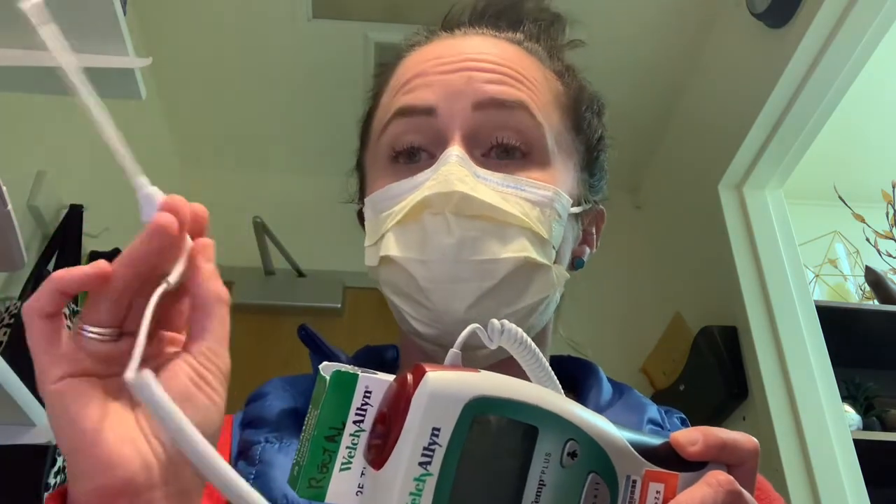You might also have oral versions of these in your emergency room or your area. Those would be blue here — so this part will be blue and the top of this probe would also be blue. So that's the difference there.